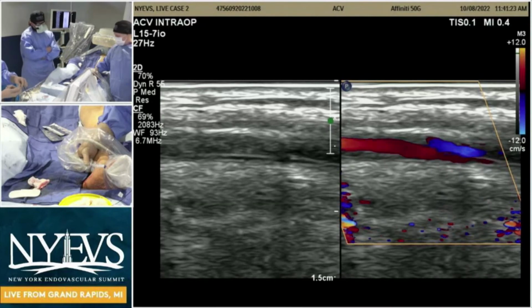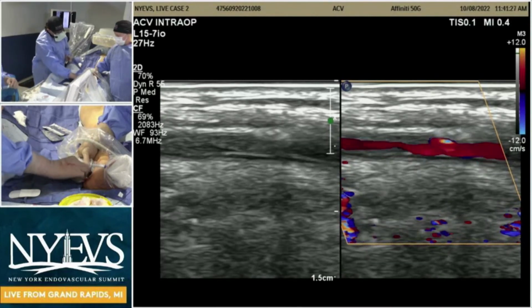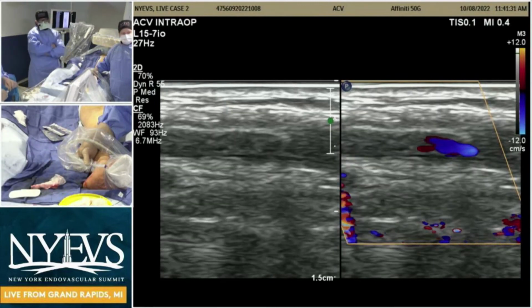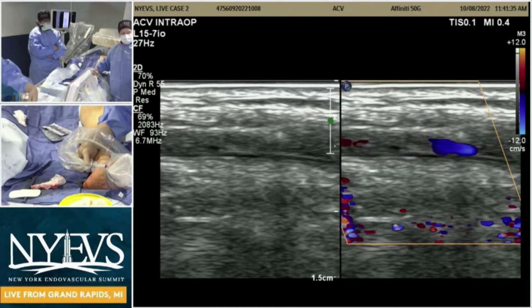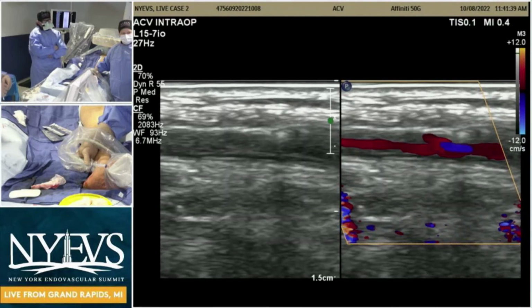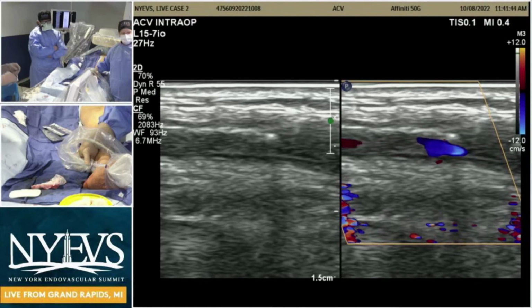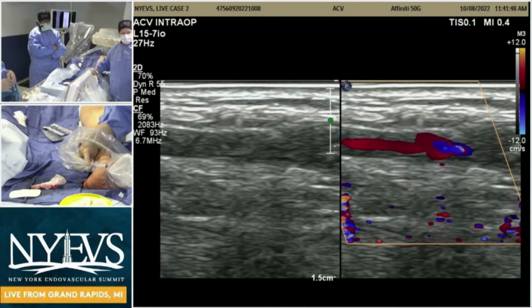We also like, in fairness, to combine that approach with PAT on the table. So you've got two different modalities that can give you that information. But the reality is, the IVUS in its current manifestation is not going to do that. And I hope that we develop some technology that will push that. However, we don't have that in the space. So that's a great answer, Asma.